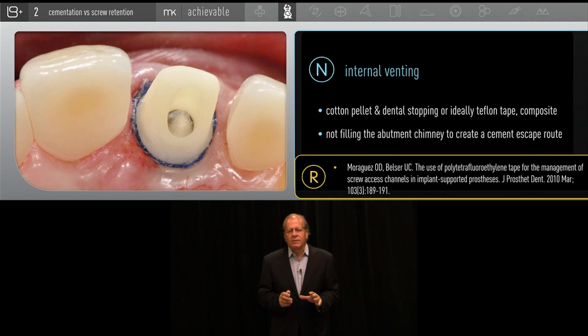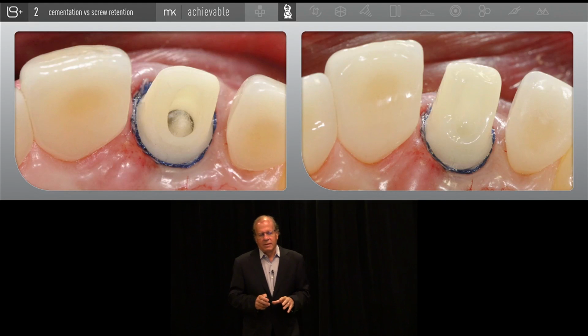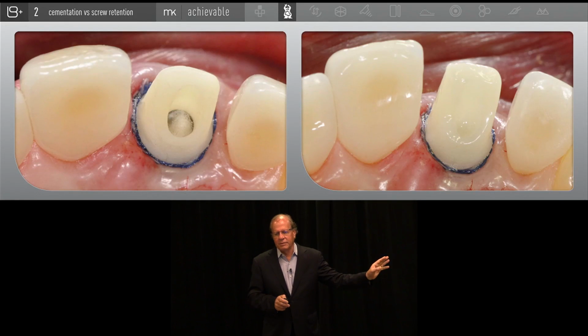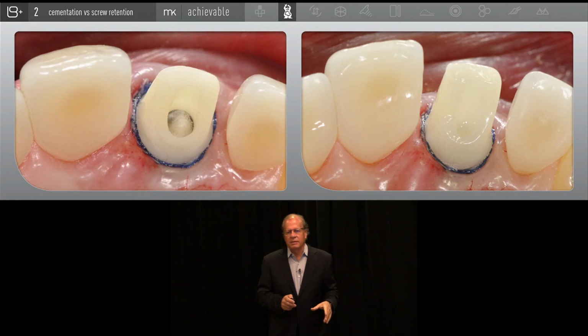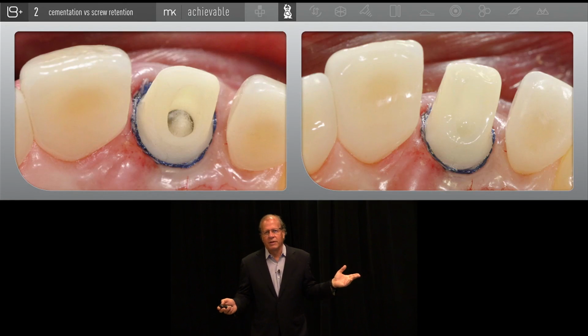there's another little thing that you can employ, because when you introduce cement into a crown and you place it over an abutment, and in this case a cemented restoration, the cement wants to run in a variety of directions. It wants to go into the sulcus and go right to the head of the implant. Very hard to clean that out. It wants to also rise along the body of the abutment and try to get out of the edge of the crown, but there's no hole, there's no vent.